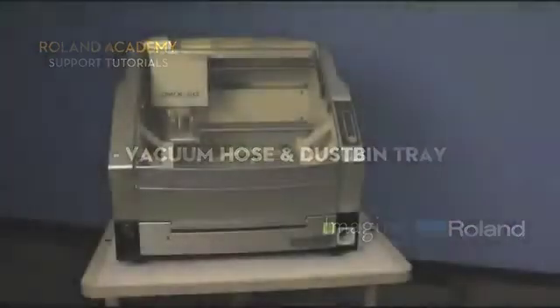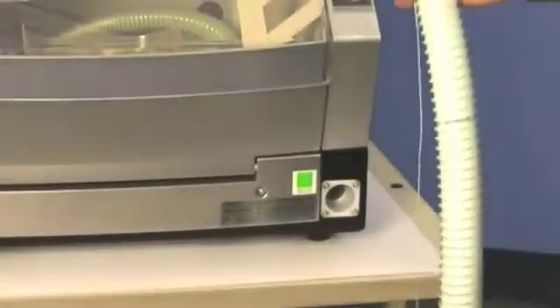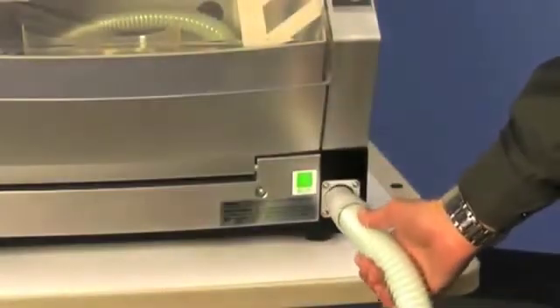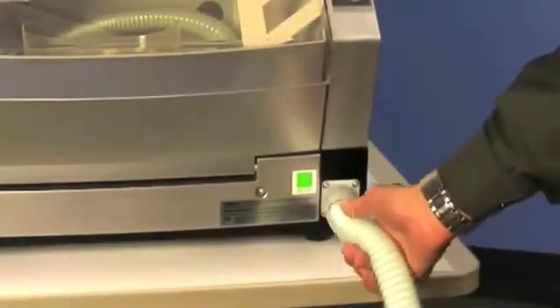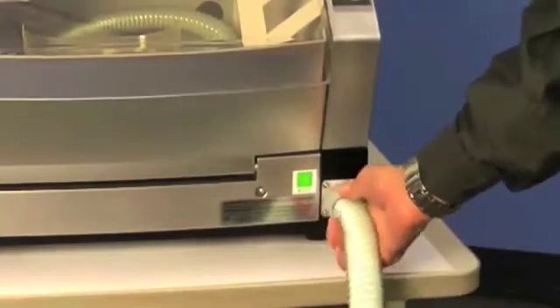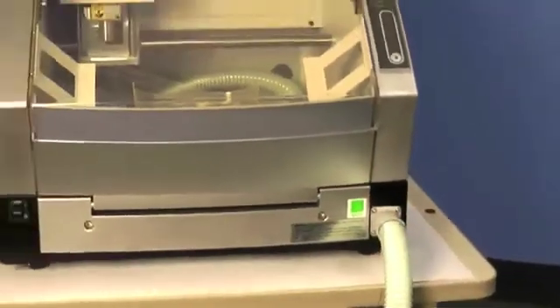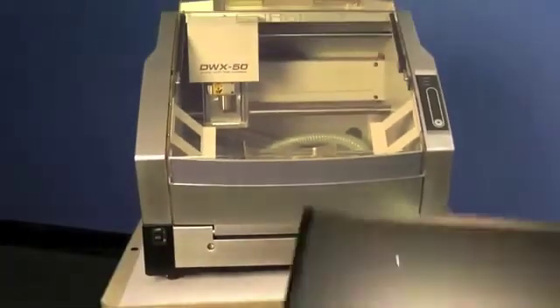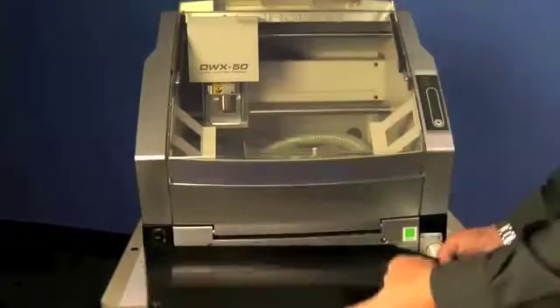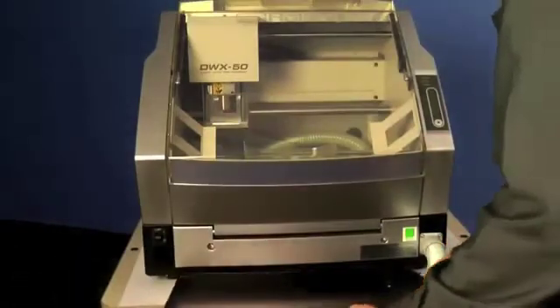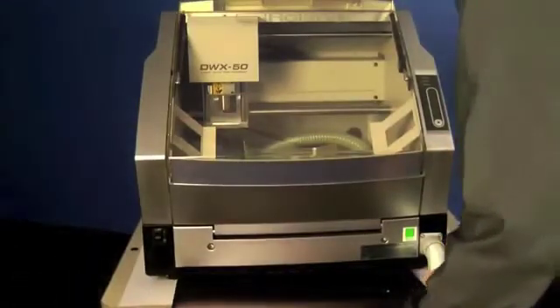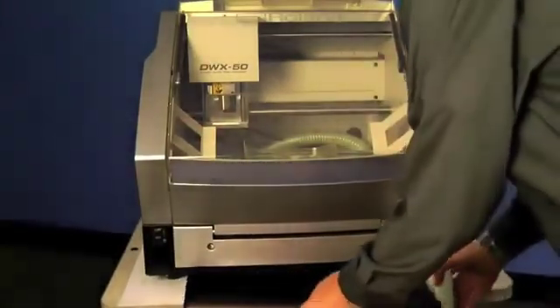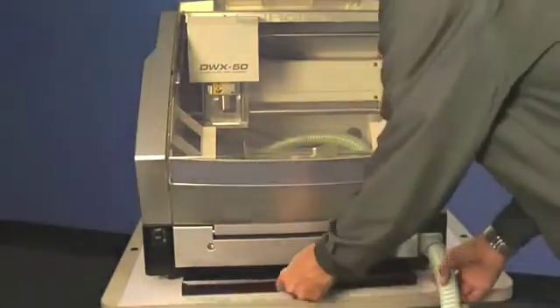Next you will insert the dust collection hose into the hole in the front right side of the machine. We also recommend grounding the wire to the Phillips head screws located in the same position. Next, slide the dust collection tray underneath the machine between the two rubber feet.